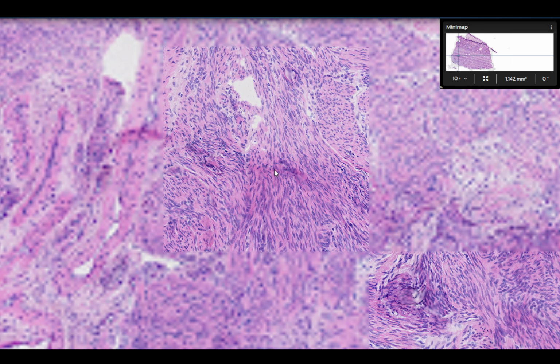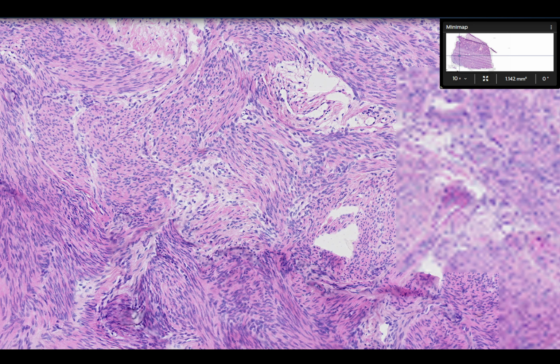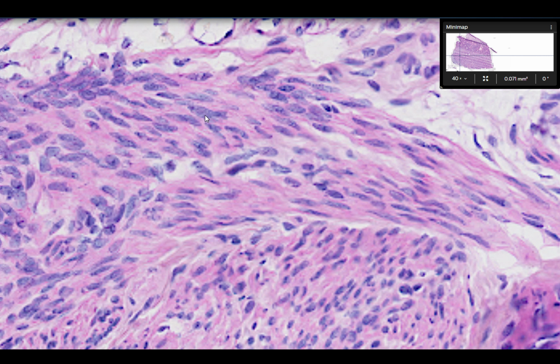The first thing of frozens is, where are we, right? Where are we? And I think this frozen is pretty straightforward based on normal histology. We have fascicles of smooth muscle. Some of them are going sideways with these nice cigar-shaped nuclei. Let's go a little higher power on these nice cigar-shaped nuclei.